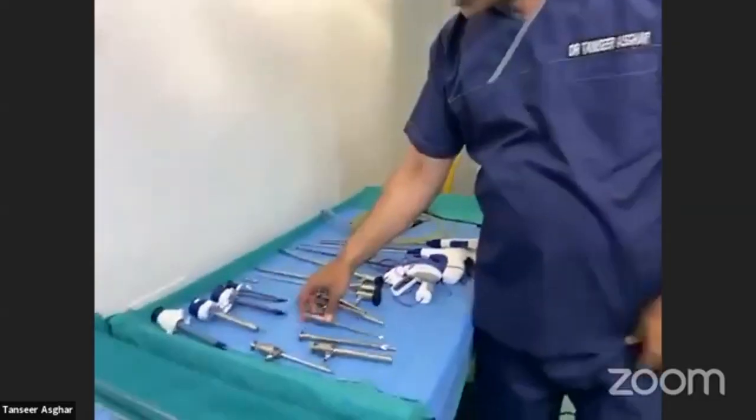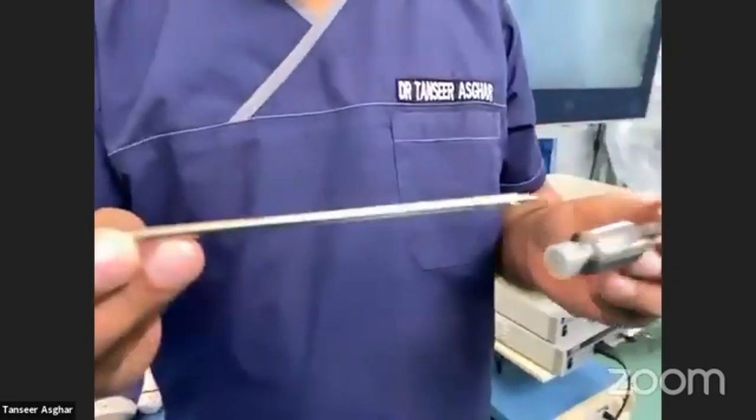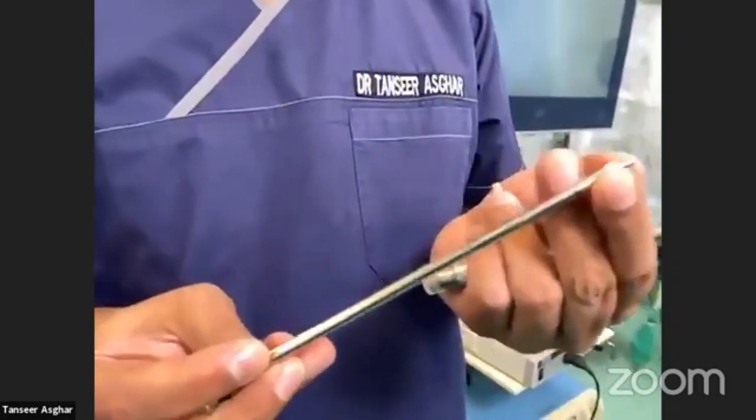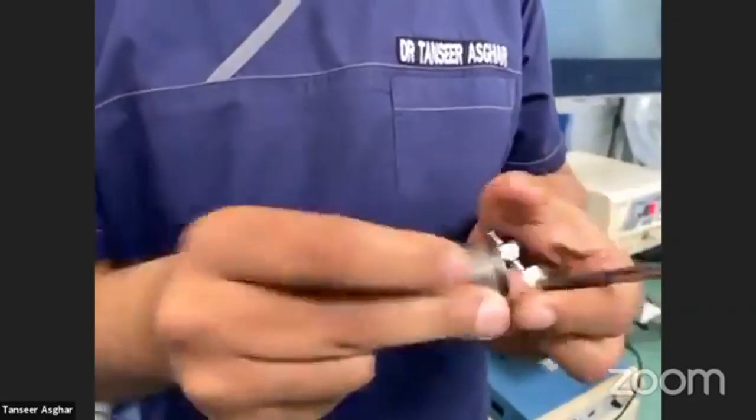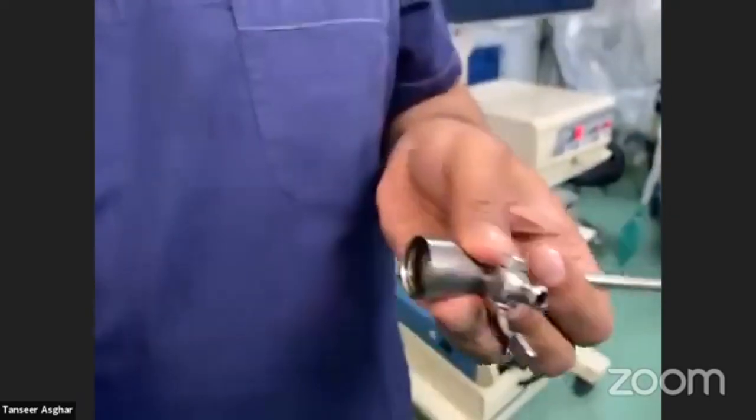Coming on to another disposable trocar — this is a five millimeter trocar. The mechanism is the same. It also has a safety valve and a shaft. It can be opened as well, and has a flap-type valve inside with a valve to control gas pressure.